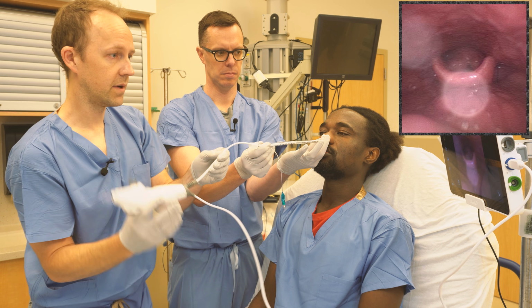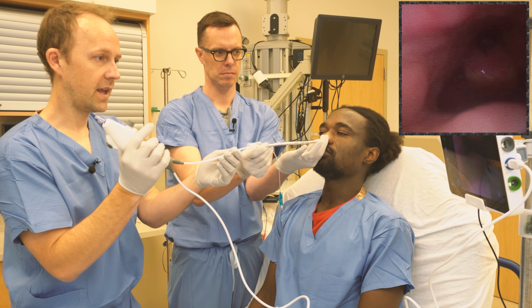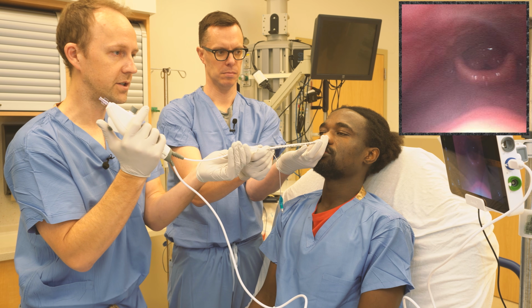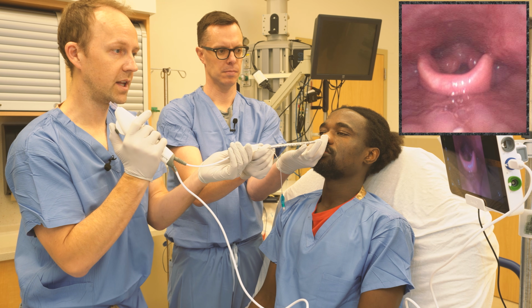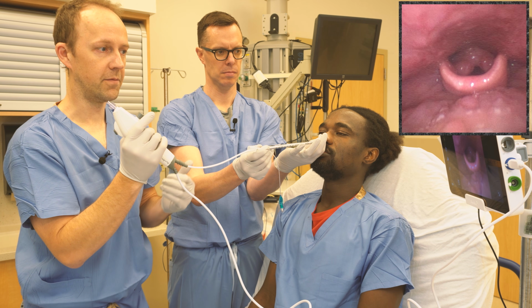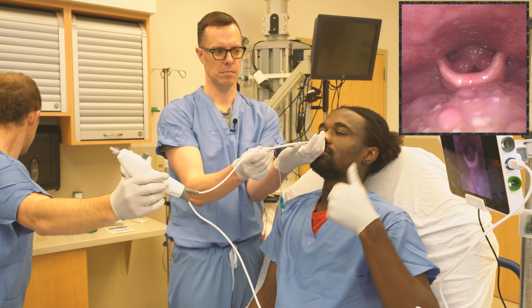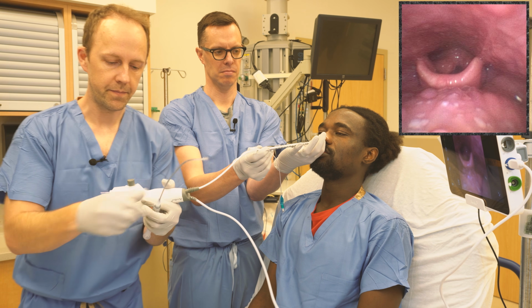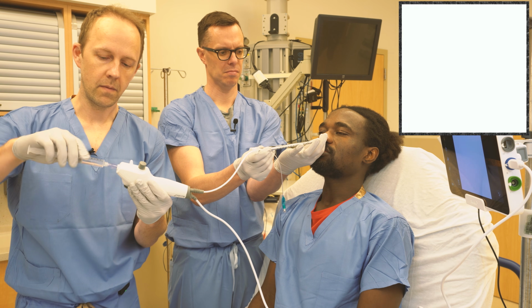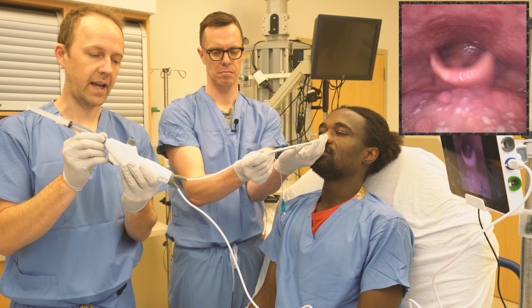And as we are actually hovering right above the vocal cords right now, the tube is in a good spot. And he has some anesthesia in the back of the throat near the laryngeal structures, but we want to make sure he's really numb before we try to advance a tube and scope. So the next step will be attaching some 4% lidocaine through a syringe. So we've got our 4% lidocaine here attached through the luer lock adapter.